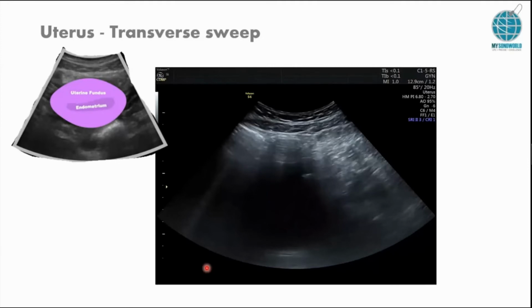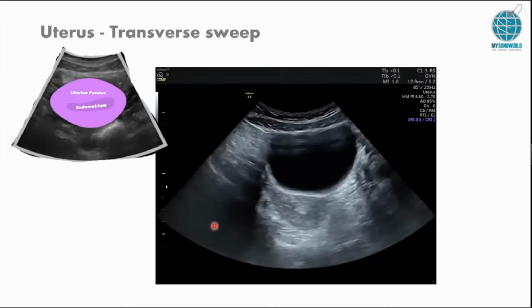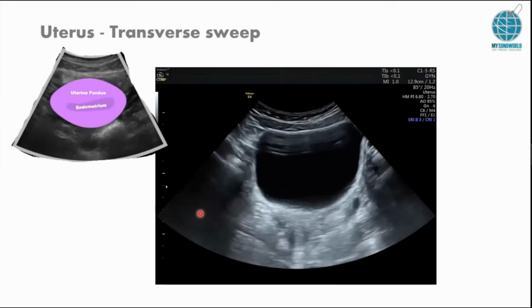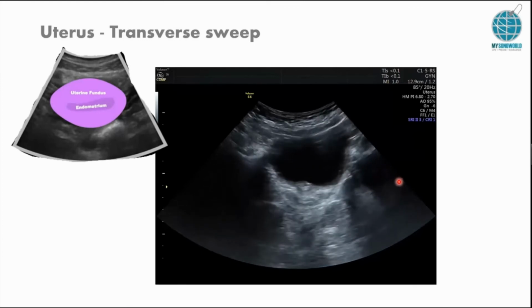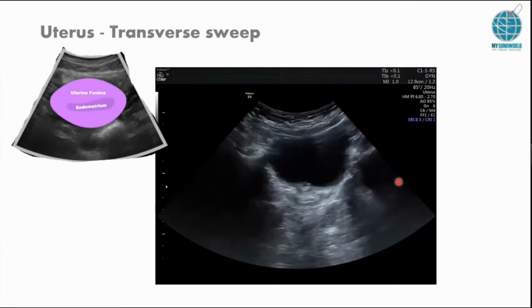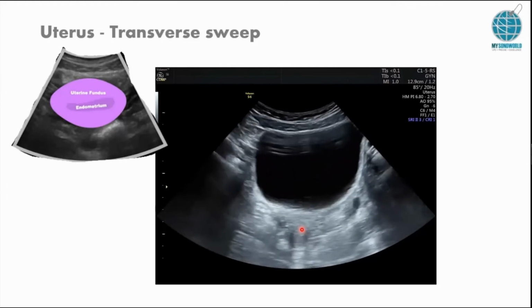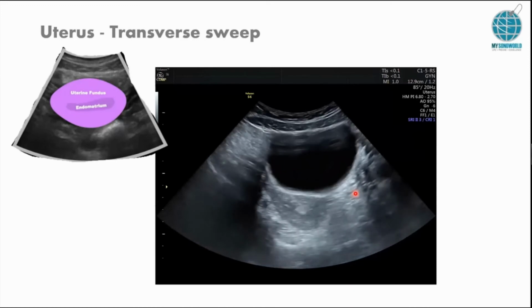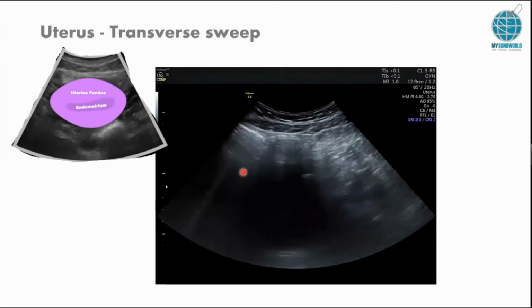So what is it that is obscuring the ovaries? You can see gas obscuring the ovaries. Okay, so these are all gas. Again, sweep. Look at this, this is the rectum. See the uterine fundus, left ovary just now, and right ovary covered with gas. Okay, so this is what you should see when you are sweeping in transverse.